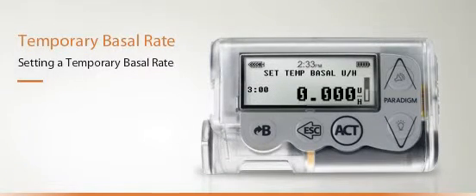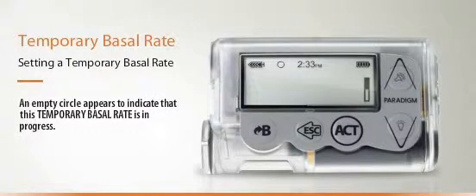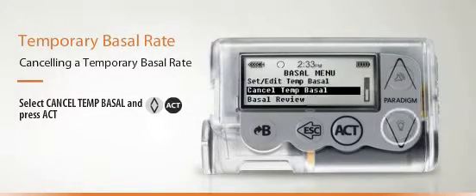Once you have set the time duration, select the units per hour using the up and down arrows and pressing Act again. To cancel a temporary basal rate, scroll to Cancel Temp Basal and press Act.